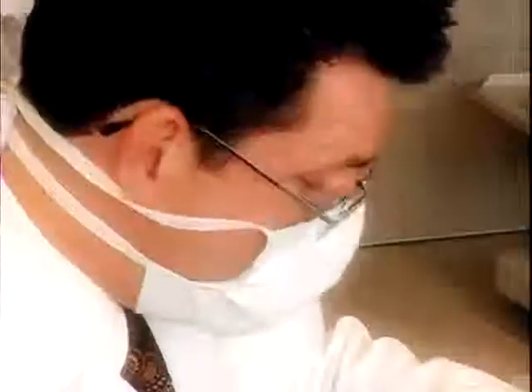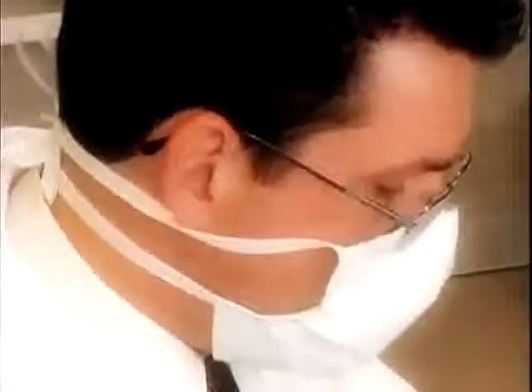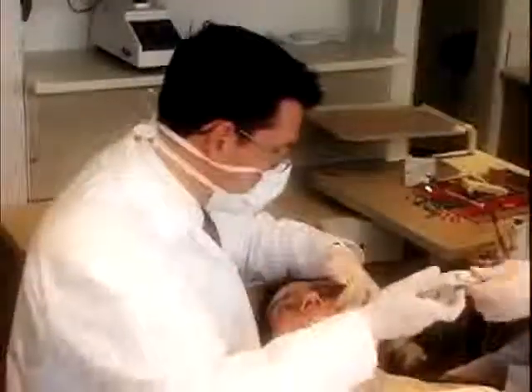Is that correct? Good. And relax a moment. And smile big. In Randy's case, we're going to be carrying the teeth one step further because I want his smile to be absolutely incredible. So, I'm going to add some material to 2 teeth further back.